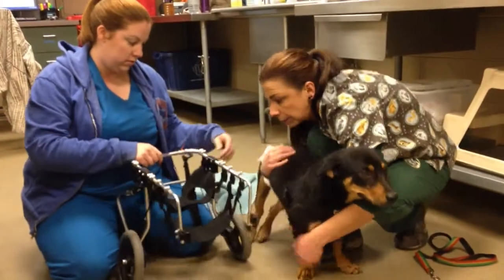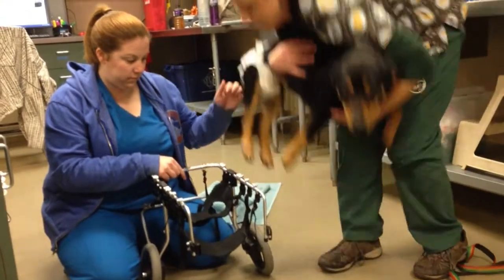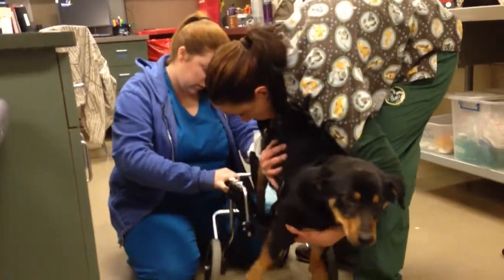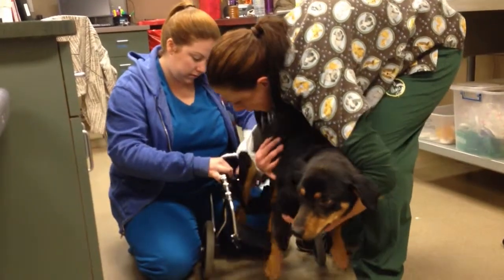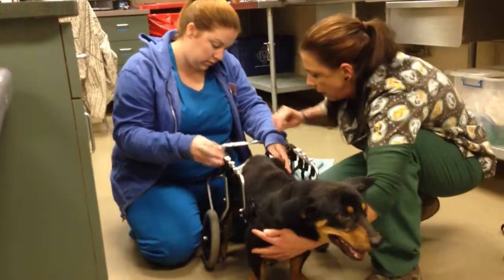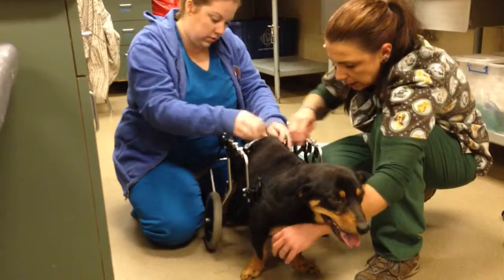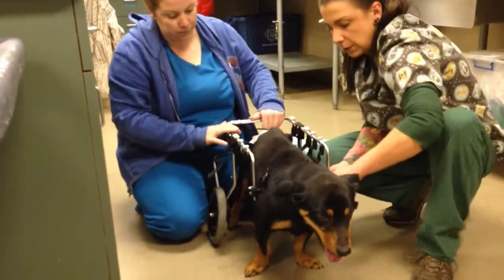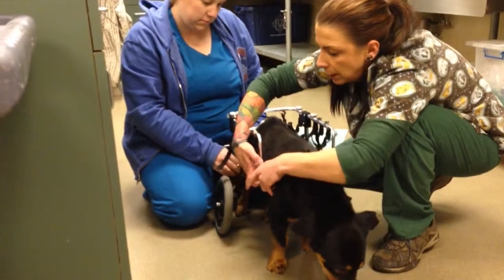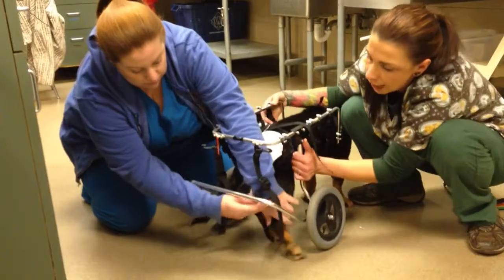Holding him and putting him in — his legs will go in these two holes here. Come on, it's okay bud, it's all right. This flap will support his chest. And then there are clips back here to keep his hind end in. These two clip here to keep him into the device. And then there are straps back here to hold up his legs so his legs don't drag.